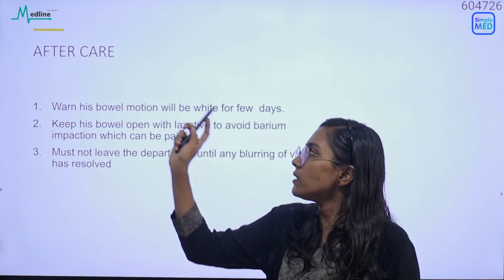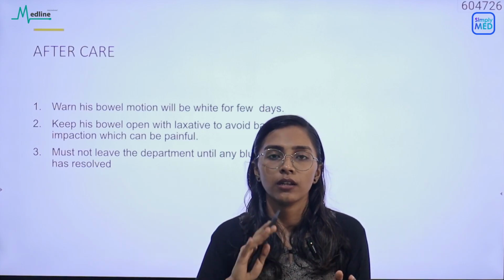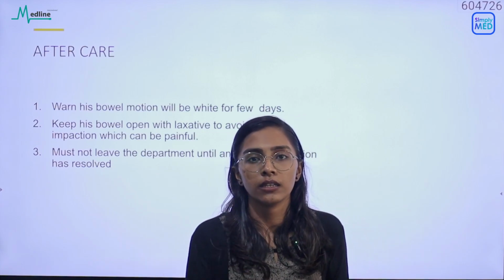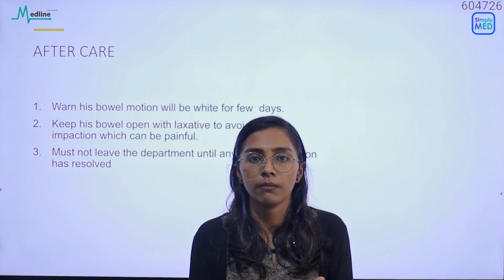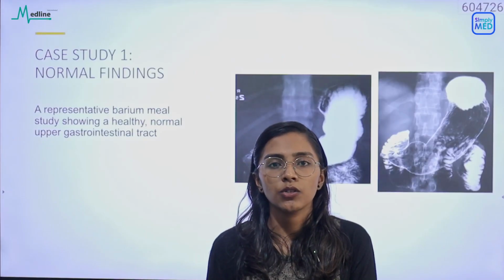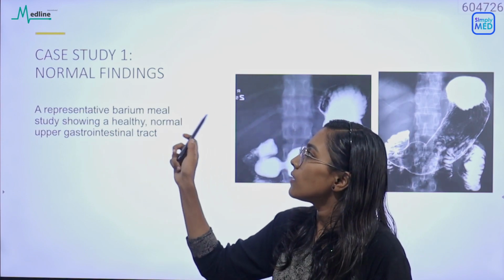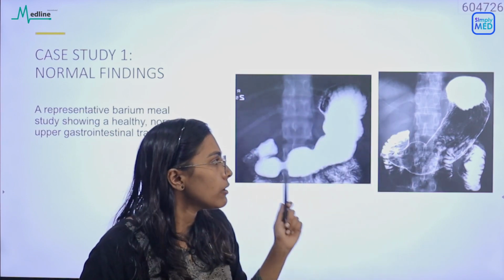With that, I guess you now have a whole clarity about the barium meal study, where it is done, how it is done, and the different methods. Let's have a look into some case studies. The first one is a case study with normal findings.